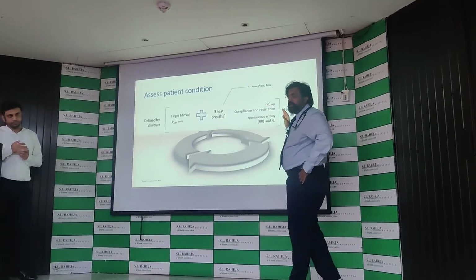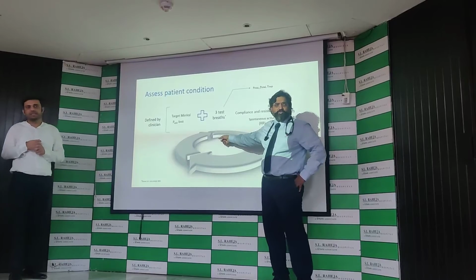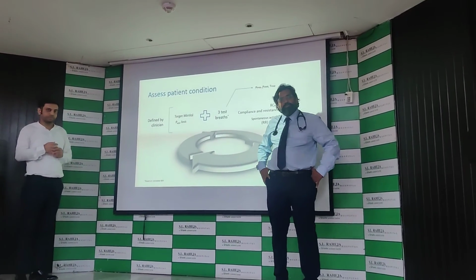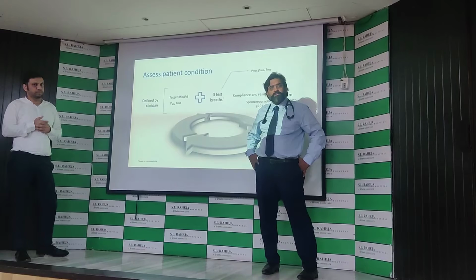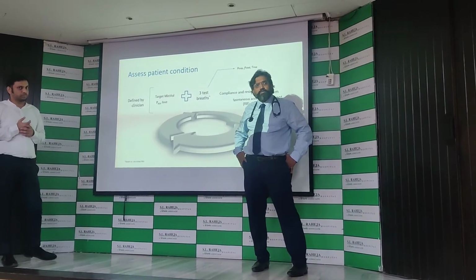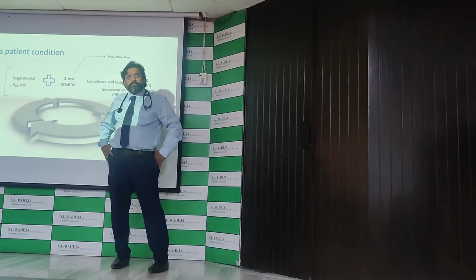My question was, how often does it do this? Or does it do 3 breaths once in a day, only 3 breaths? No sir, initially when you set the target minute volume percentage, at that time it will check for all these things. Anytime after you change any settings related to target minute ventilation, it will also try to re-verify that the tidal volume and the rates are accordingly matched to the patient's respiratory mechanics.